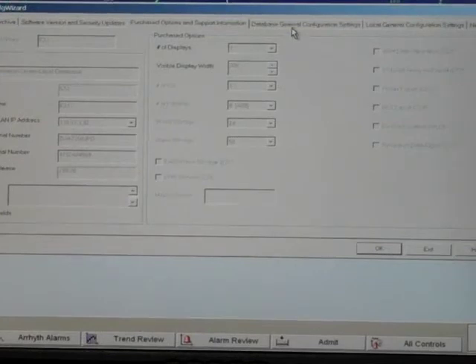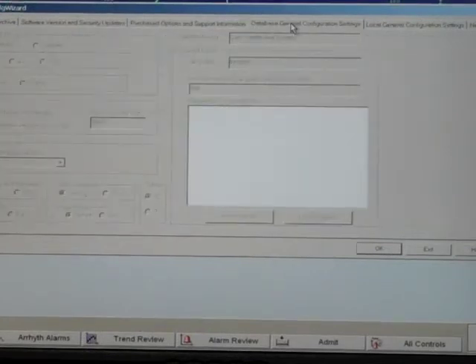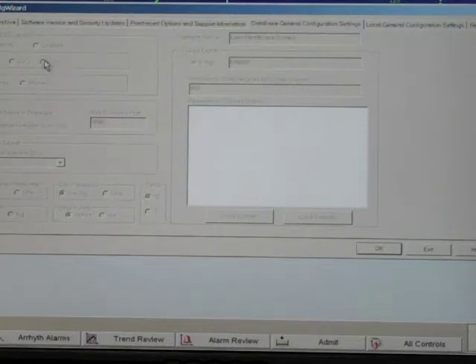Next, click on the database general config settings tab. In this screen, you will be looking for the layout options to make sure the system is set to preference.